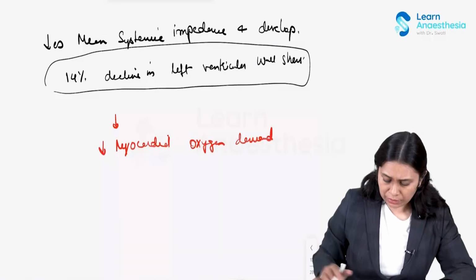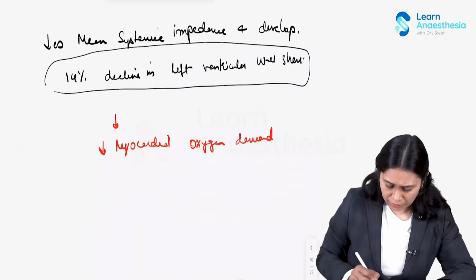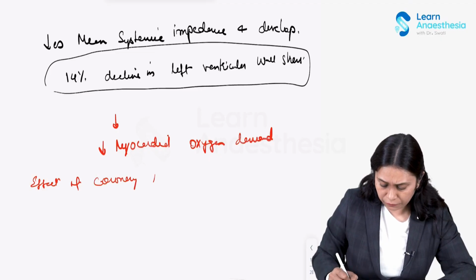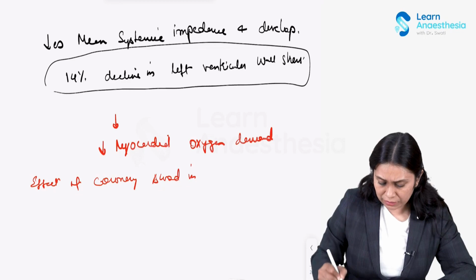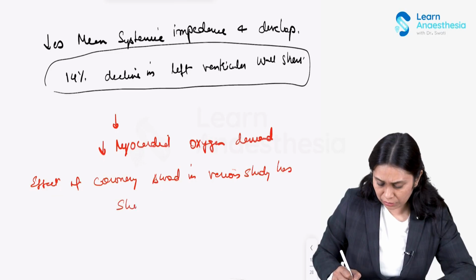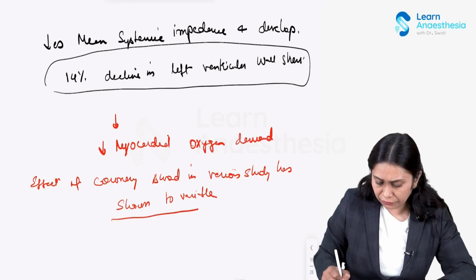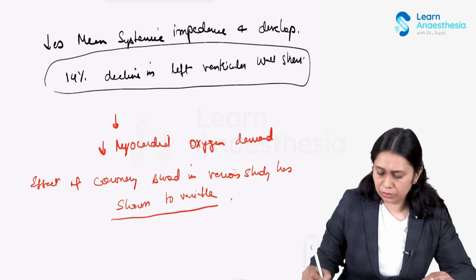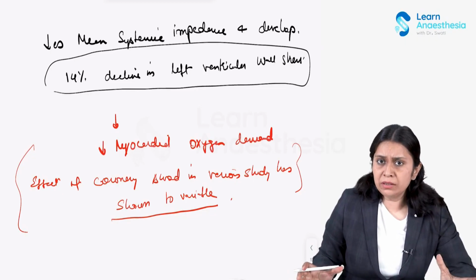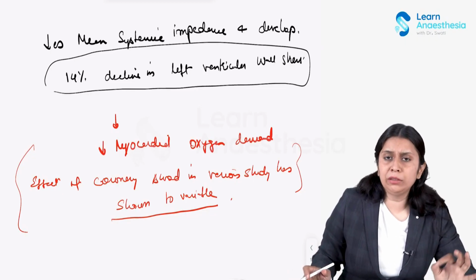So remember that in various studies, the effect on coronary blood flow has been shown to be variable, from no effect to significant augmentation, but its main USP is that it is improving the coronary blood flow.